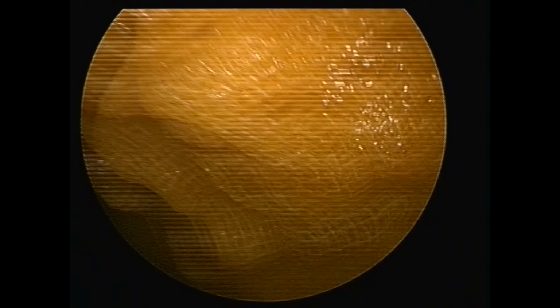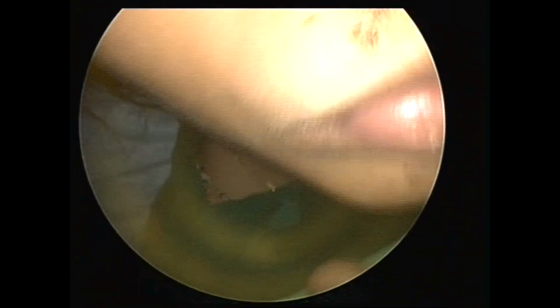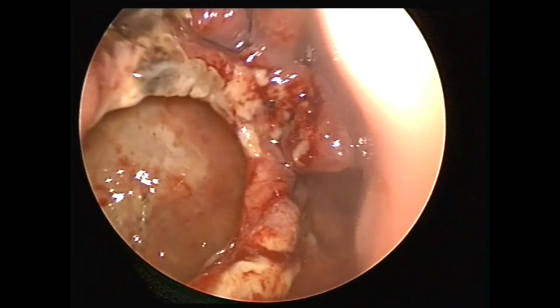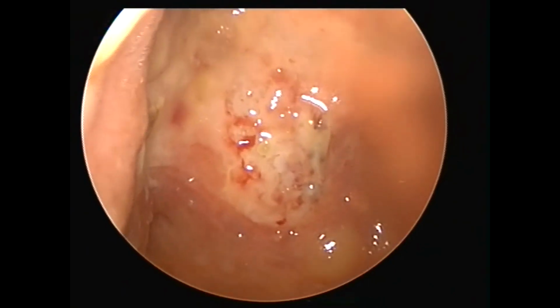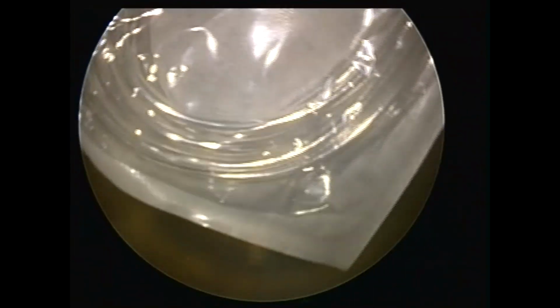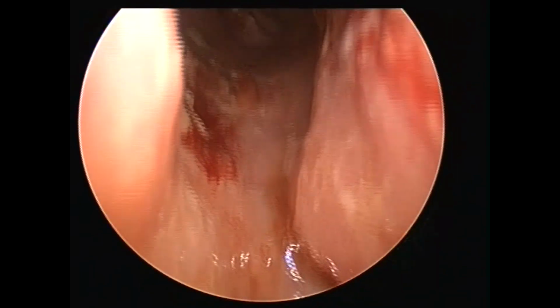Right now I'm going to show you the maxillary sinus with the help of an inverted 70-degree endoscope. If you've seen the video, you must have seen that the maxillary sinus on this patient's right side was severely affected. Now, as you can see, that's the complete 360-degree view of the patient's right side maxillary sinus: anterior, lateral, posterior, superior, roof, all the walls of the maxillary sinus. You can see this just with the help of a 70-degree endoscope facing downwards.